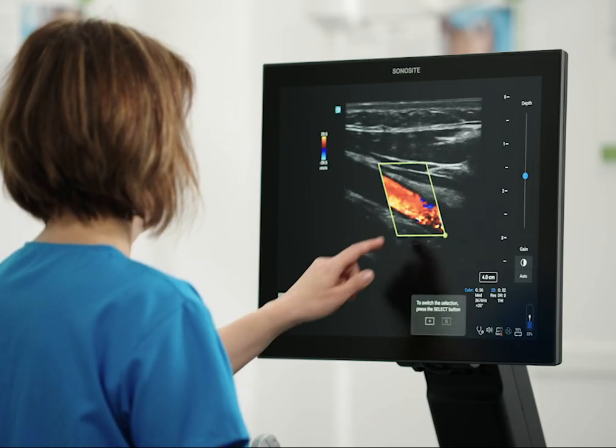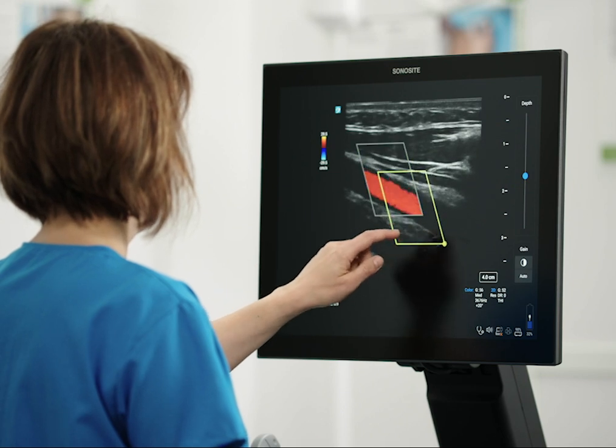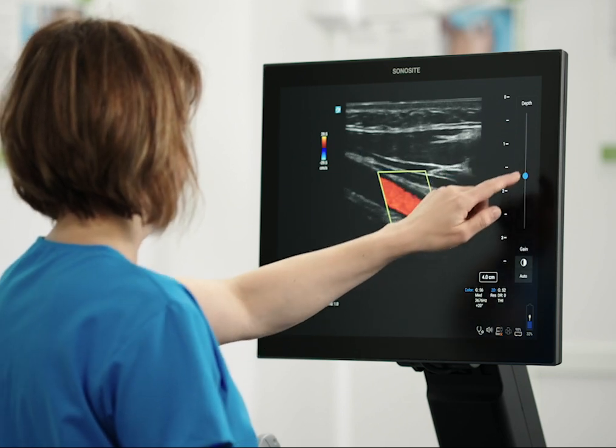In addition to the touchpad, you can directly control the items on the clinical monitor by touching them. You can even adjust the depth and gain.